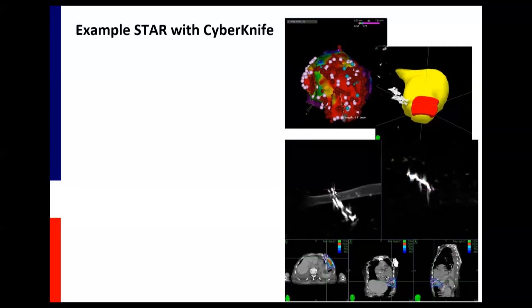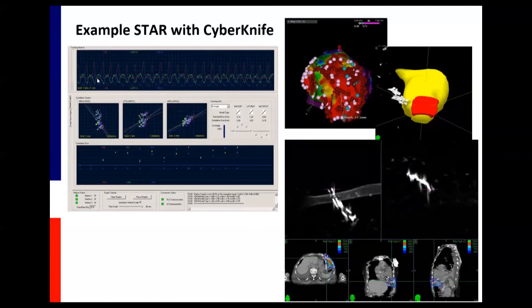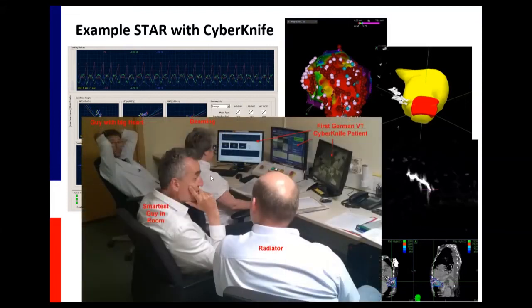Here you see the tip of the catheter. Actually, we have some motion that you can see here, unfortunately some motion blurring, and a second tip. But using the tip for treatment was very easy to do. You have this motion modeling here. You see some errors in the motion modeling. Why is that? Because you see the cardiac component on top as correlation error. The CyberKnife system can only compensate the respiratory motion, and the correlation error that you see here is basically the cardiac component. But the treatment accuracy is still below 3 millimeters, which is really nice. However, again, a long treatment.